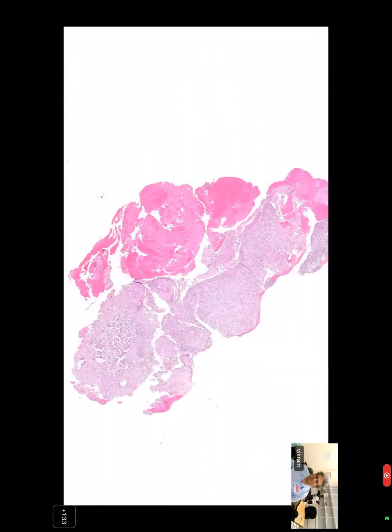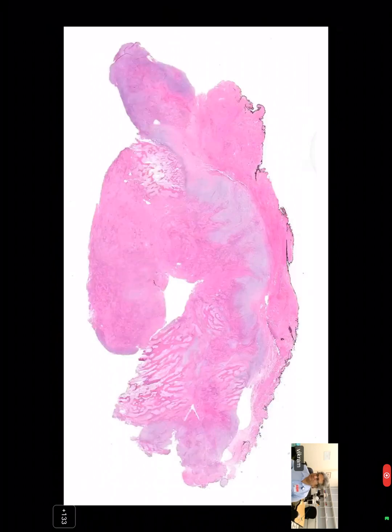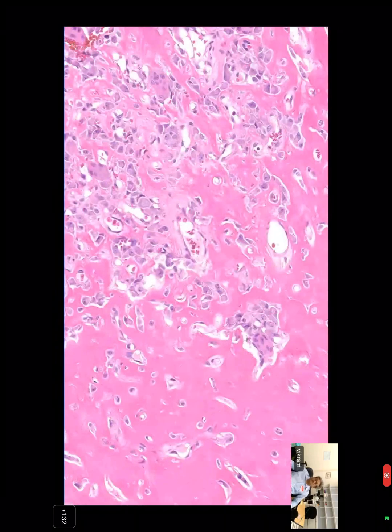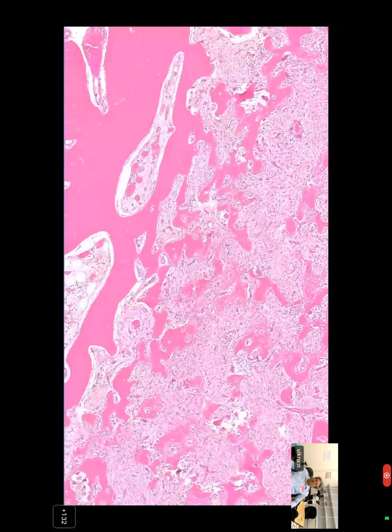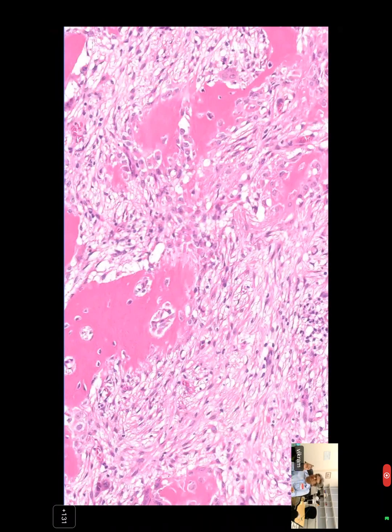So, what did you have as a diagnosis? Karishma, while we go through this, don't look at the screen because it's going to blind you. Did you have a diagnosis? So it's a fibro-osseous lesion? Great. Yes, sir. And what do you want to call it? So your differential is fibrous dysplasia, a very well differentiated osteosarcoma, which is very unlikely because it's so well circumscribed, osteofibrous dysplasia, and adamantinoma, right? Yes, sir. And how are you going to tell the difference between all of these?